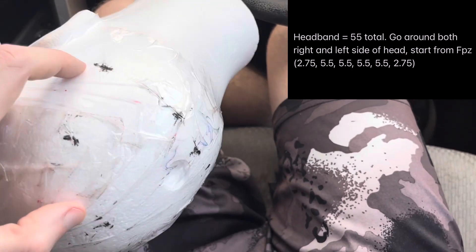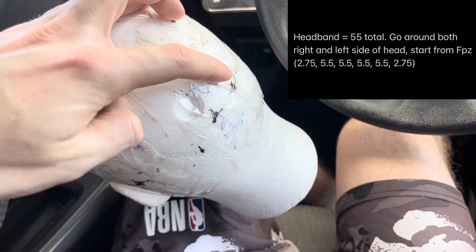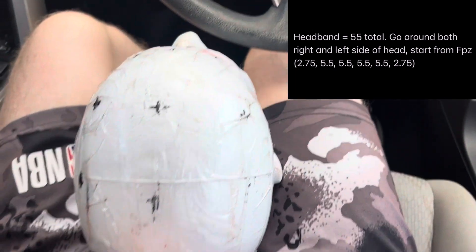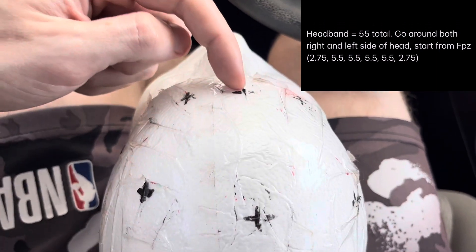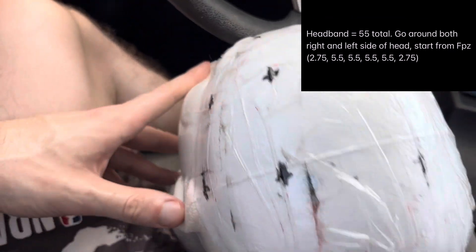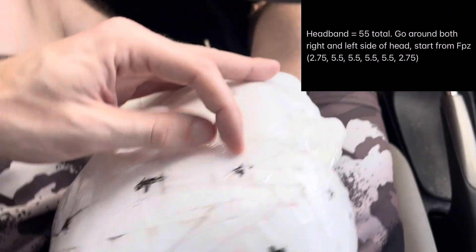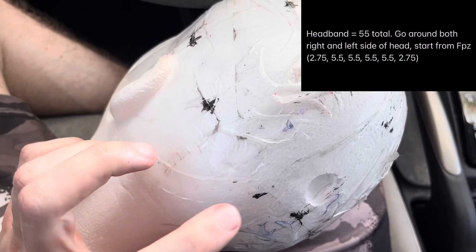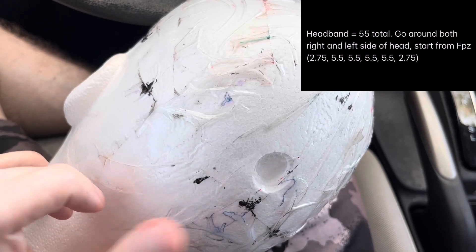Continuing the right side of the headband: T4 to T6 is 5.5 cm, T6 to O2 is 5.5 cm, and then O2 to Oz is 2.75 cm. Then starting back at the front for the left side: FPz to FP1 is 2.75 cm (5%), then FP1 to F7 is 5.5 cm, F7 to T3 is 5.5 cm, T3 to T5 is 5.5 cm, T5 to O1 is 5.5 cm, and O1 to Oz is 2.75 cm to check your work.